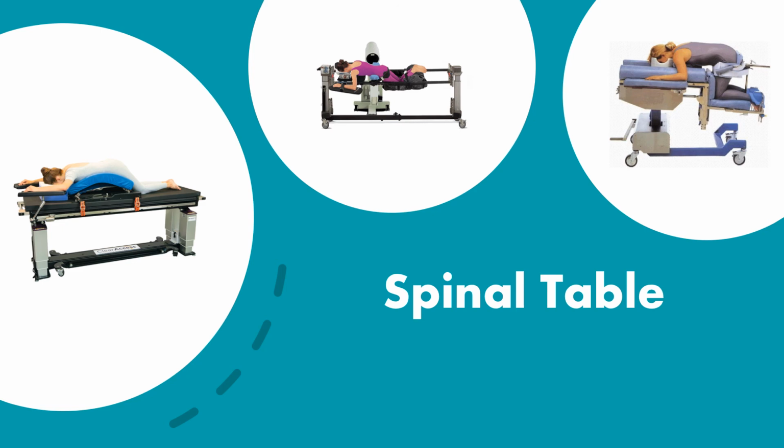Again, there's going to be some pre-planning before the patient comes in. They're going to get anesthetized and intubated on the gurney and then log rolled onto the table and gently moved into the position depending on which type of spinal positioning device is being used. Again, we want to make sure that for the female that the breasts are not being impinged by any of the positioning devices and that the male genitalia is not being impinged on any of the devices as well.